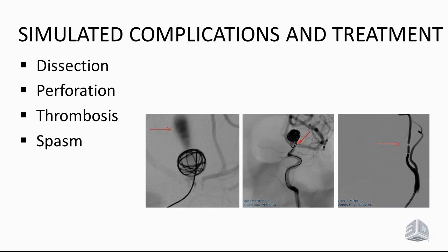I mean, in the context of a very, very hyperacute and serious problem, whether it's an ischemic stroke or a subarachnoid hemorrhage from an aneurysm, I think one of the things as we try to train our fellows who come from both neurology, neurosurgery, and neuroradiology to get them to adapt to doing these procedures is to think ahead. What are the maneuvers that you can possibly do to get out of such a horrible problem should you be faced with one of these complications?